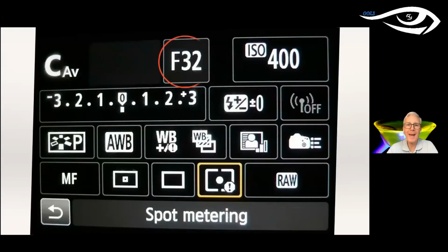So if I look at the back of the camera, these are the settings that we just went through. RAW means that you're not compressing the images. It's not a JPEG. It's not a PNG or other thing. It is the full information, and you want that because if you do processing on the level of the camera, then you can't edit the photograph later. So you want RAW, which gives you the maximum information.